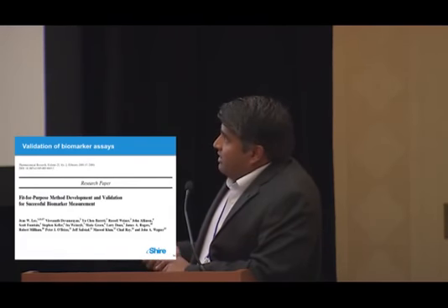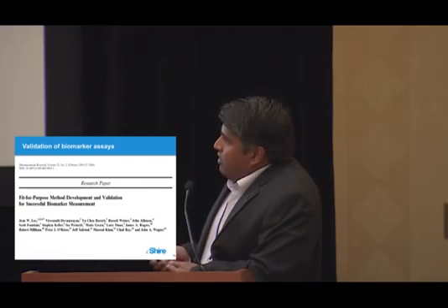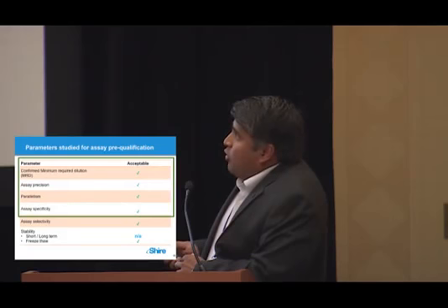Voila, we tried this in SIMOA. You have AEB on the y-axis and nanograms per ml of RANKL. You can see a limit of detection of approximately 100 femtograms per ml, way better compared to the DuoSet and also ELISA, because it is 24 times more sensitive than the ELISA I showed you earlier, which was 5 picograms per ml. But again, this is the first time we ran on SIMOA, and the background was 0.04 AEB.